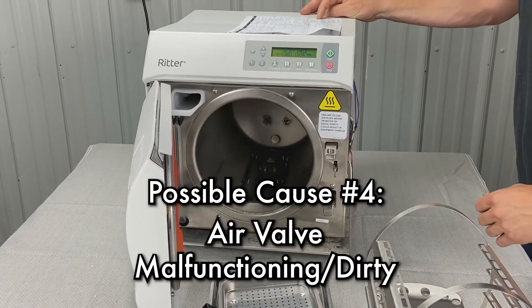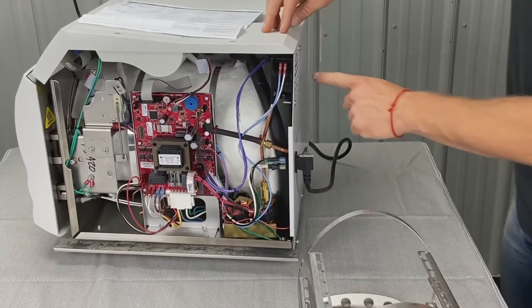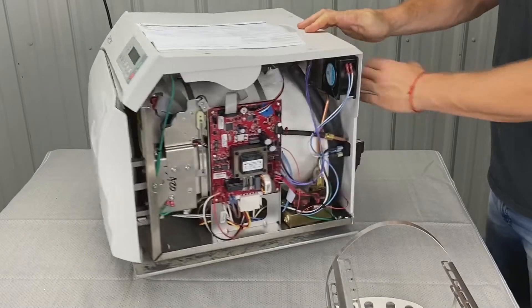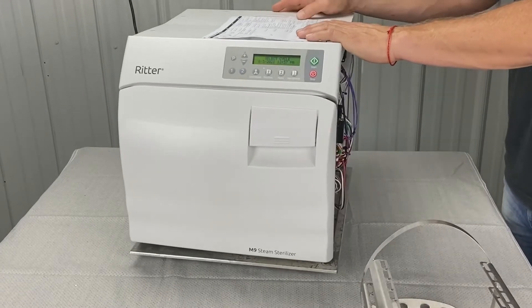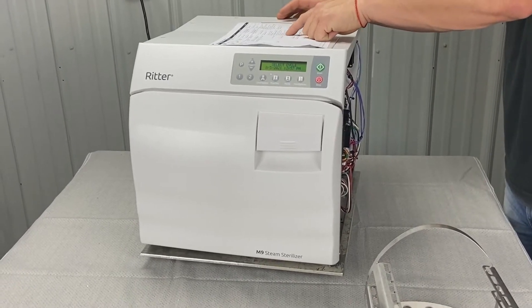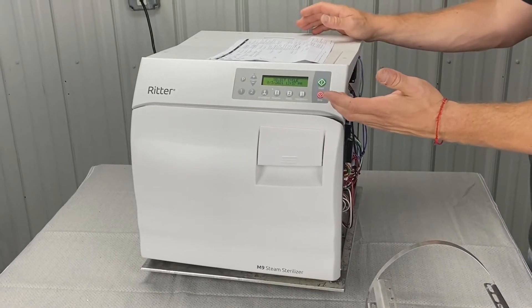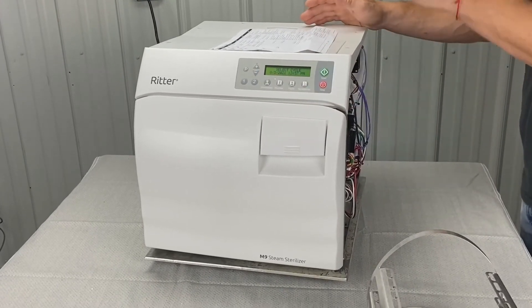Air valve malfunctioning or dirty. The air valve is back here — there's a valve that opens and closes as the chamber condenses. You will have to take the top cover off and the back panel off to inspect it. That's more of a technician service repair, though end users can perform it. We have some videos, but I recommend calling us first. We can also go into diagnostic mode — we can test to make sure that it's engaging. You put it in diagnostic mode, hit the start button, get to a certain point, and test to make sure that it's clicking.